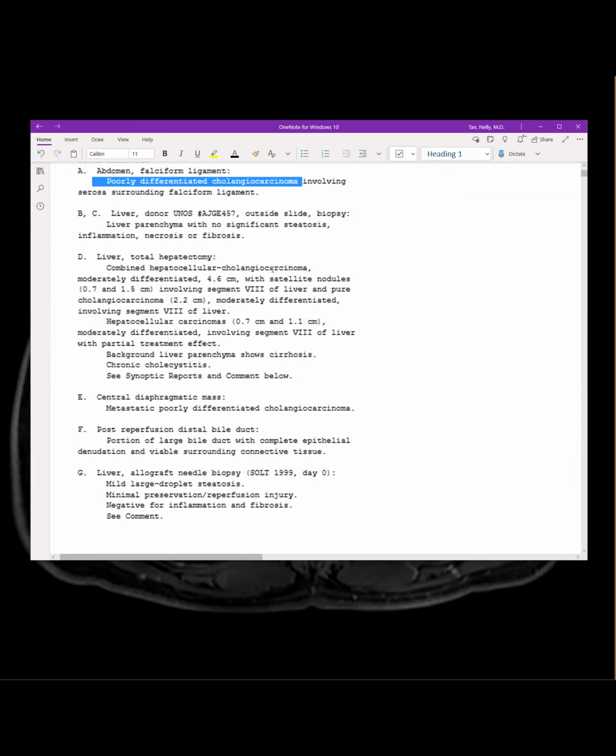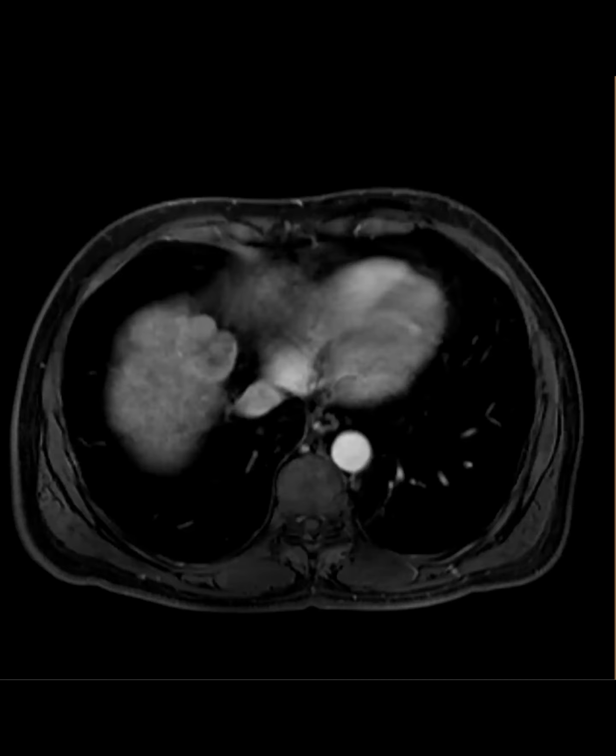Right. So there are two things here. There are some combined tumors that actually meet criteria for LR-5, so they're not miscategorized. They actually just meet criteria. And those tend to behave biologically as conventional HCCs. There are a few papers that show that, prognosis-wise, those combined tumors behave more like conventional HCCs, so maybe that's not such a good idea.